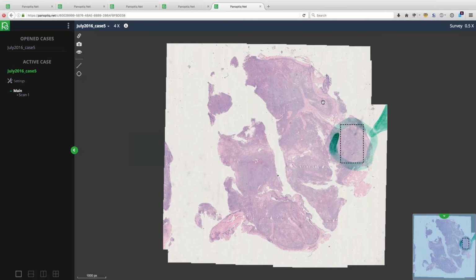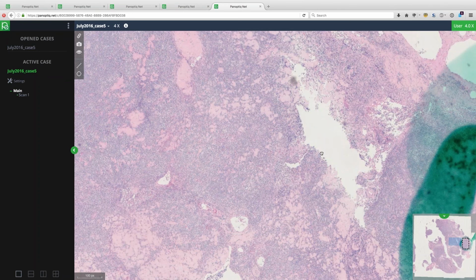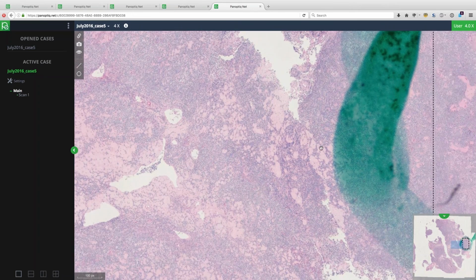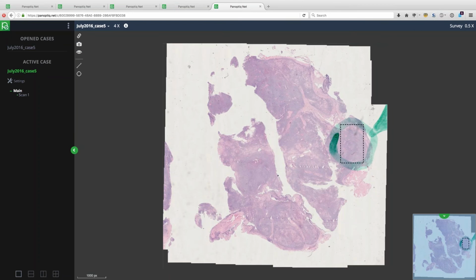I'd like to show the participants a feature that I had great trouble showing with low mag. There we go. Thank you. Just keep it at that for now. So this is the scanned image from that material, from the retroperitoneum, which I believe is a lymphoid mass or matted lymph nodes, maybe even. What I can show using the digital pathology images here is, number one, effacement of normal nodal architecture. That's almost virtually impossible using still images taken from a microscope camera.